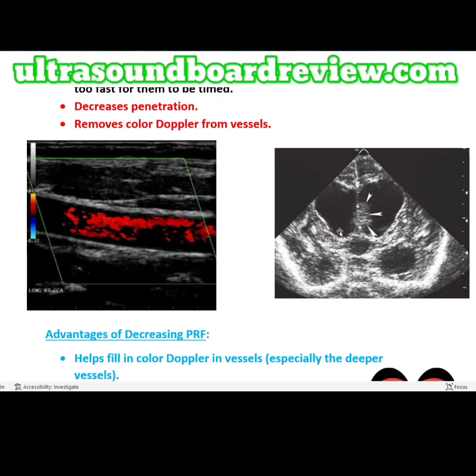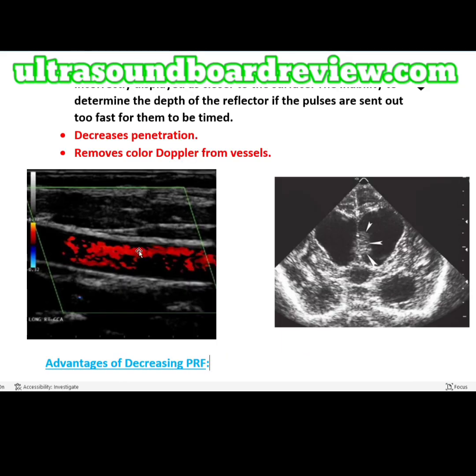To resolve this artifact, you're going to have to decrease your PRF, which will increase your PRP, which will get rid of this artifact. Then to fix this image, you're going to have to decrease your PRF, and if that doesn't work, you can also increase your color gain.